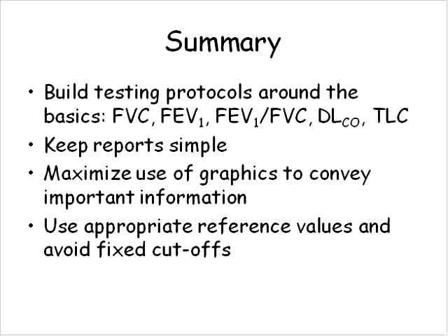If you're interested in measuring diffusing capacity or lung volumes, that almost requires that you have some way of sealing off the airway, either by using the patient's tracheostomy tube with a cuff on it, or taking out the tracheostomy tube and putting some sort of a device over the patient's stoma, which hopefully can be sealed in order to allow you to measure the DLCO or lung volumes.